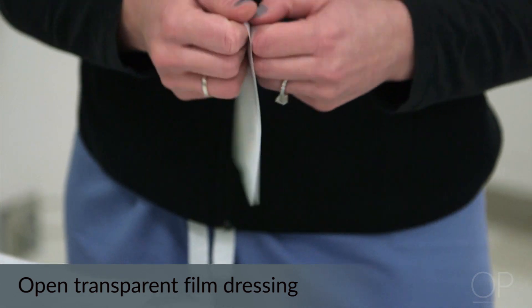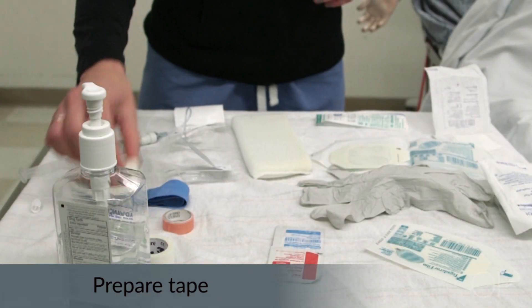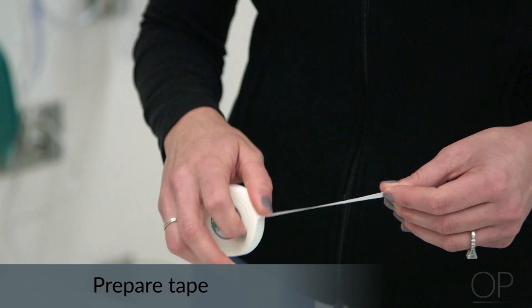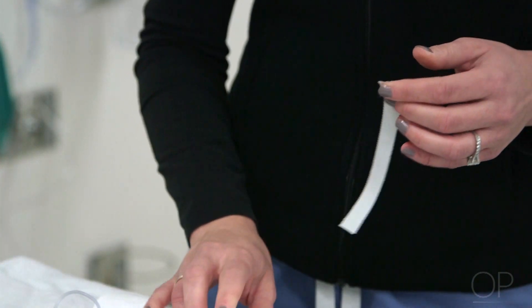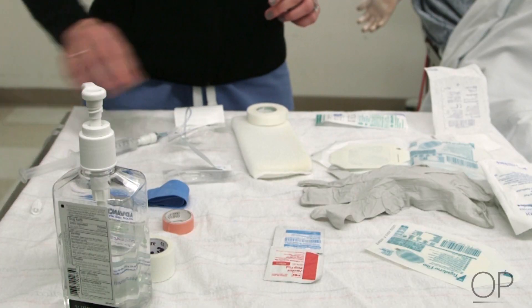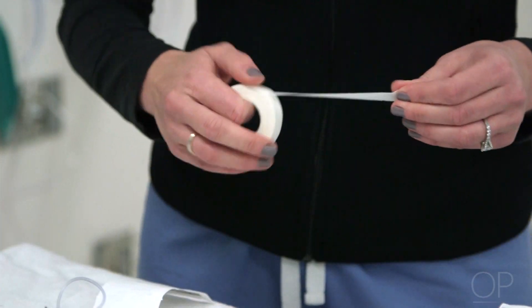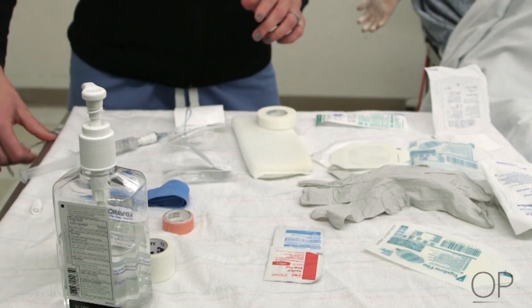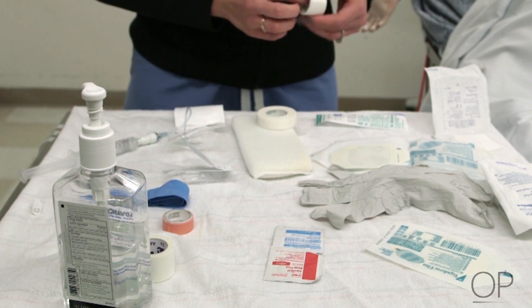Open the transparent film dressing. Next, prepare your tape to have it ready to secure your IV once in place. There are many variations of taping. Tape is prepared by tearing a few half-inch pieces along with a few short one-inch pieces. Their application will be demonstrated shortly.